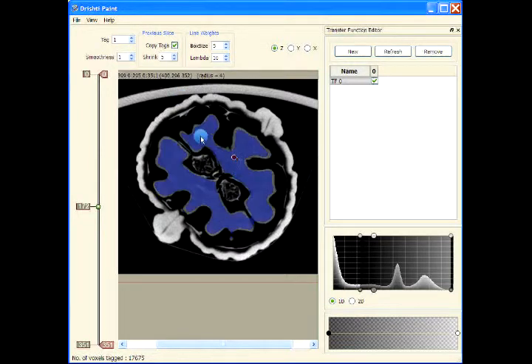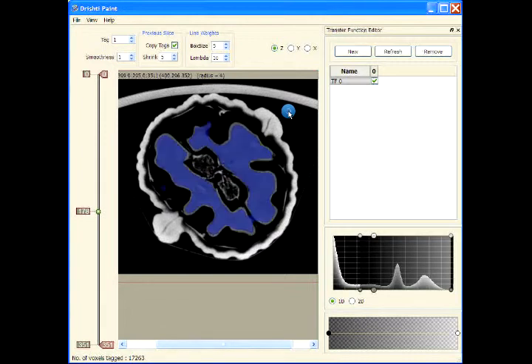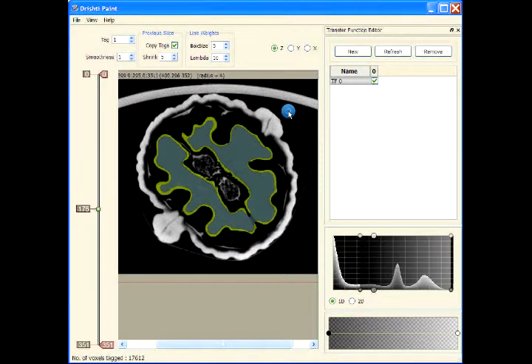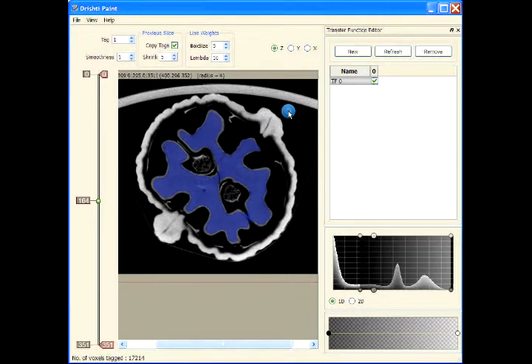So we can use this information. We don't need to do any painting of the slices, or keep the user painted information. We can just use the information from the previous slice, and then press T, next slice T, next slice T, and so on. And similarly we can go up the slice rather than going one slice below. You can go one slice above, and so on.